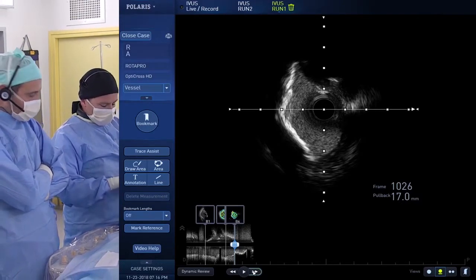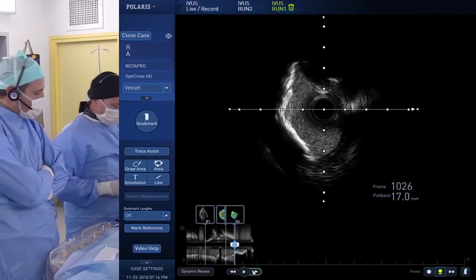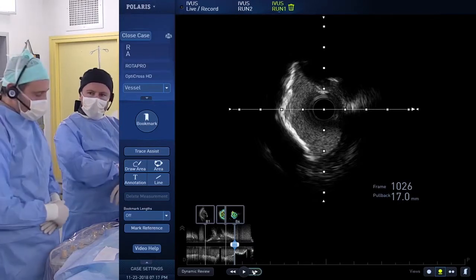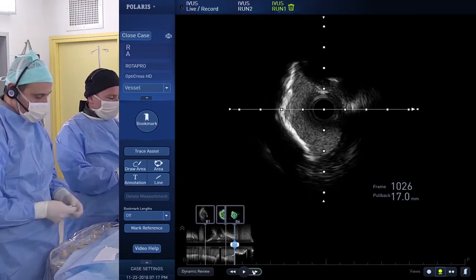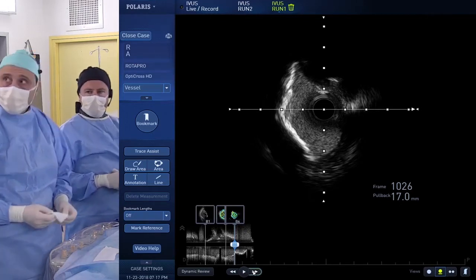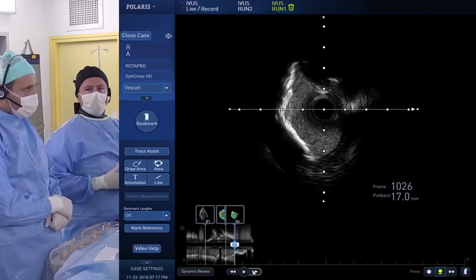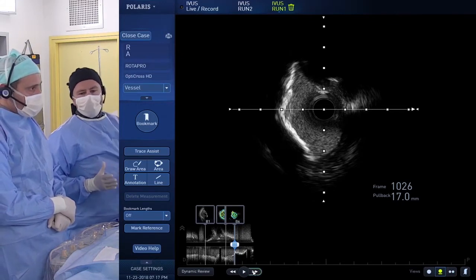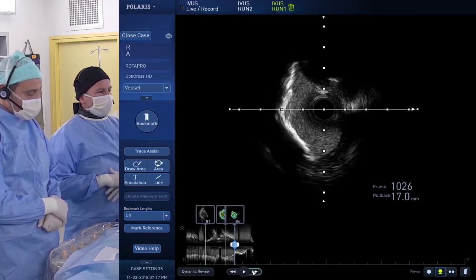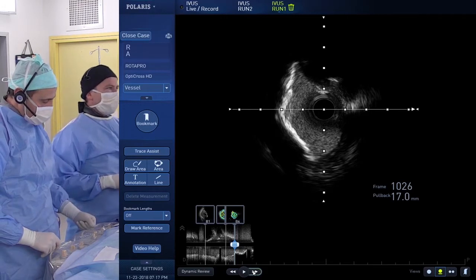The first thing concerning the long calcification in the LAD and in the left main, I think it's better to prepare the lesion, and we have to prepare it not with a balloon, but with rotational atherectomy. Thanks to that, we will prepare everything, the left main and also the LAD, and then we will be able to place at least 2 wires to finalize the PCI with balloon preparation and also stent implantation in the LAD, and I think in the left main.